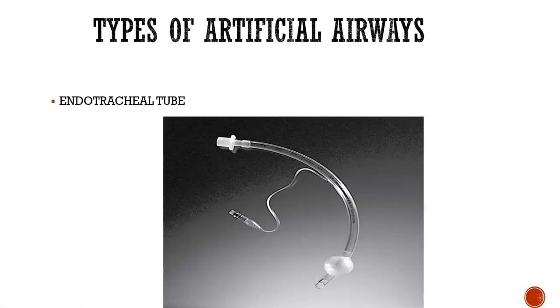They're your BFFs. So this is the tip of the cuff, or the tip of the tube, and this is what should be 2-ish centimeters above the carina on an x-ray to know that it's in the right spot. And then this is where we connect our patient to the vent. Okay, that's where our little vent tube is connected.